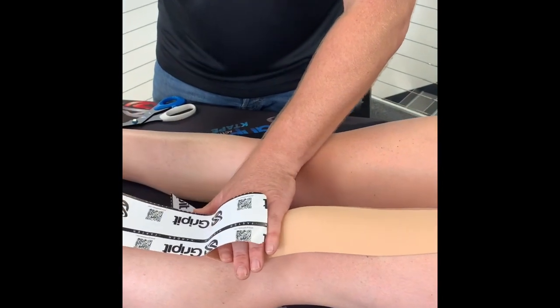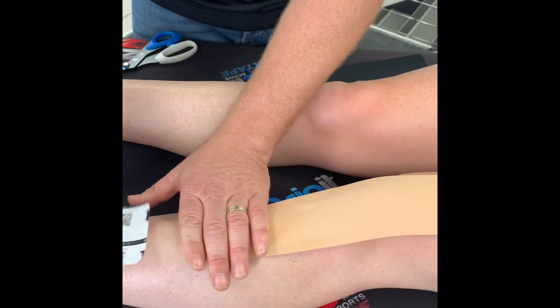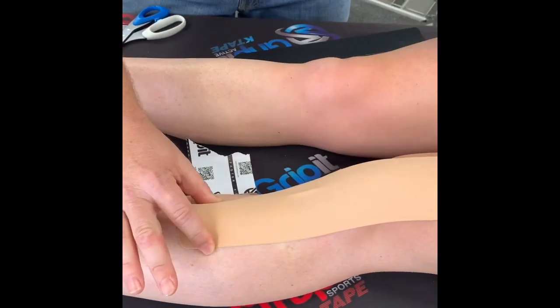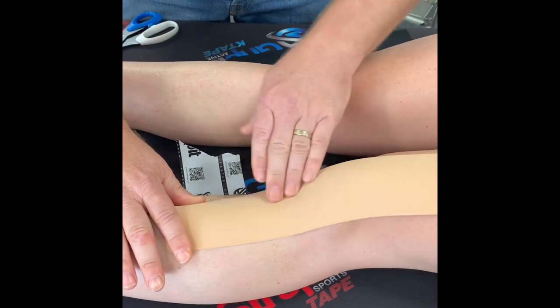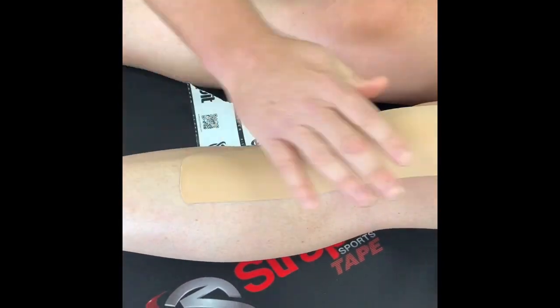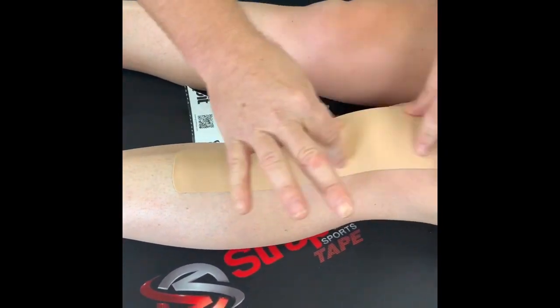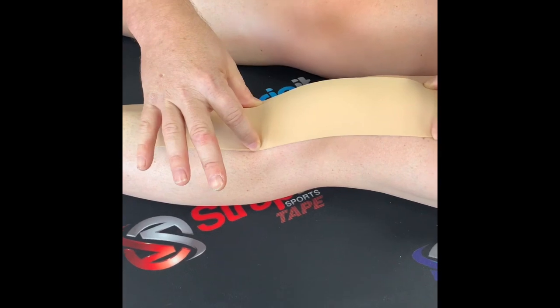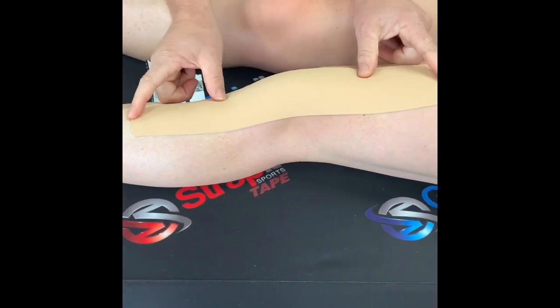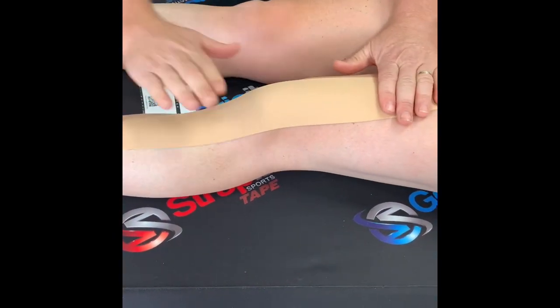and come in close here. You can see here, I'm applying that anchor, again, with no stretch at all, okay? So I've been able to create 2 anchors with no stretch. And as the body part moves, because this is full extension, as the body part moves, the energy goes into the middle area and where the tape is storing and releasing, but that obviously needs to pull at an end, so make sure your ends are long. And remember, no stretch in the tape.